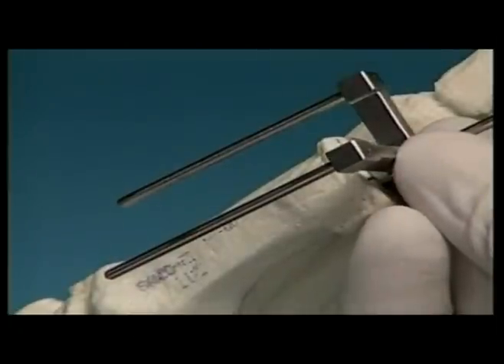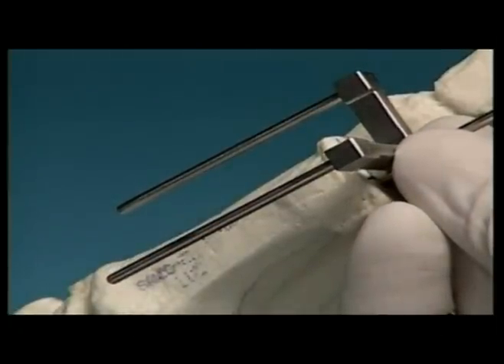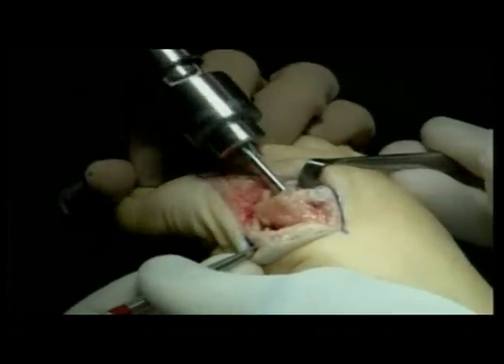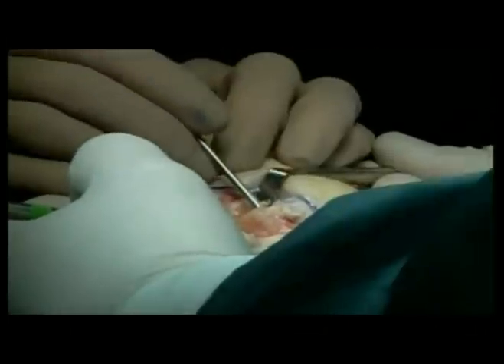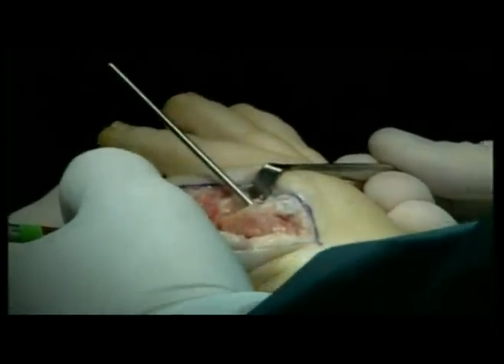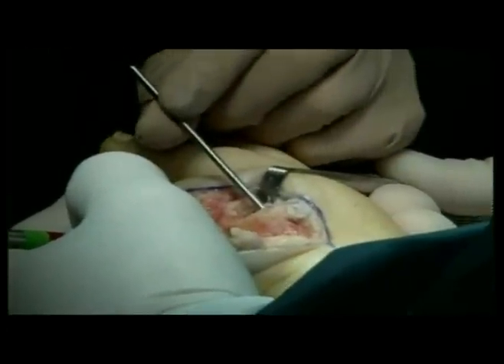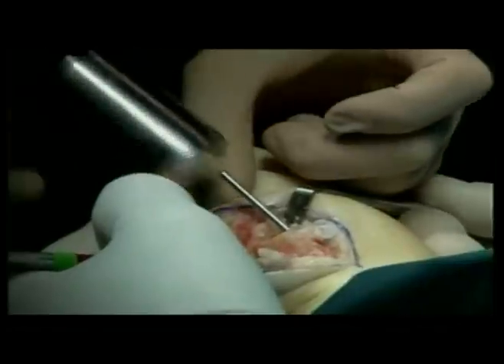Use a mini-C arm to visualize the metatarsal shaft and aid in positioning the guide pen. If alignment is not correct, remove the guide pen and reinsert. As an alternative, the alignment guide can be used to determine proper guide pen alignment. With one alignment rod over the dorsal aspect of the metatarsal shaft and the other over the medial aspect, tilt the drill and guide pen until the guide rods are parallel and centered on the metatarsal shaft. You may reposition the insertion point if the alignment rods are not centered on the shaft in either the medial-to-lateral or dorsal-to-plantar plane.